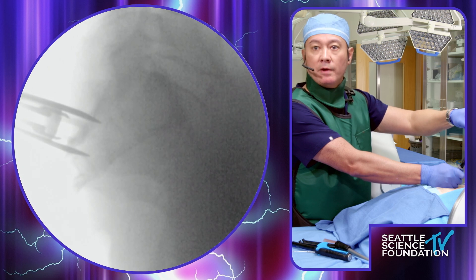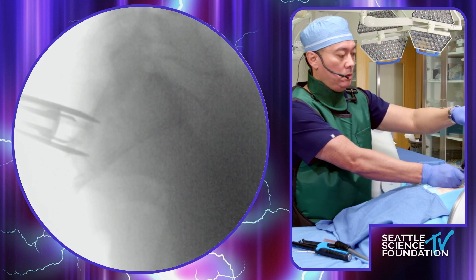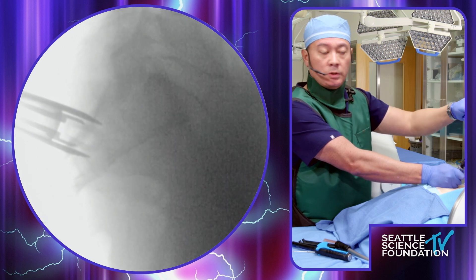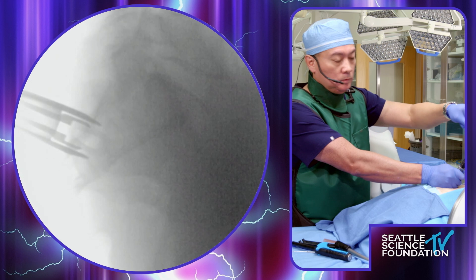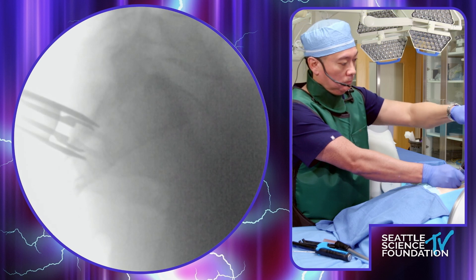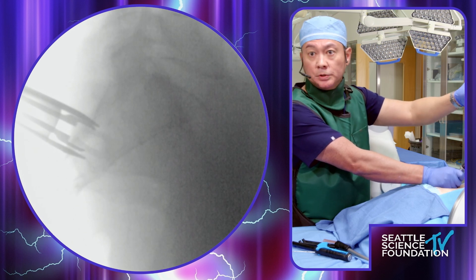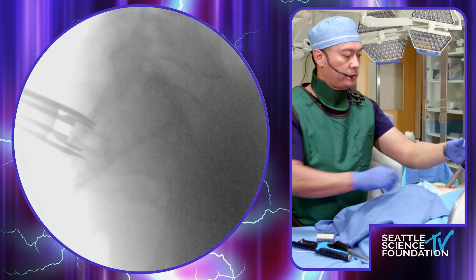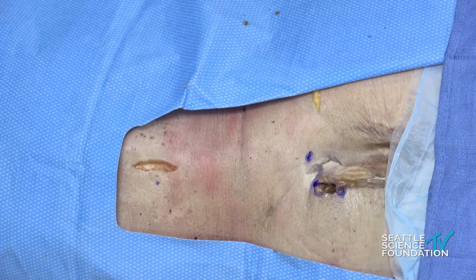You can see the allograft — it's a little translucent there but coming in nicely. Some minor adjustments to get it into the same spot where we decorticated. At this point we're pulling the inserter out and pulling out the cannula. Let's get an AP view.